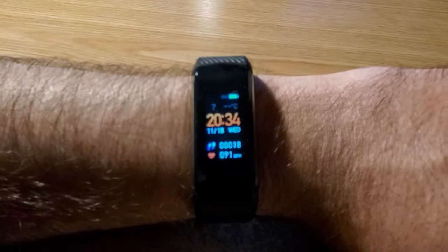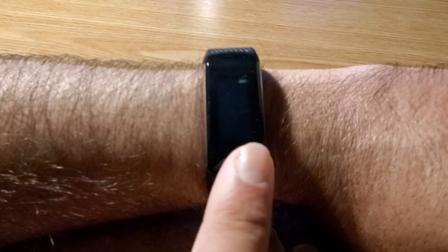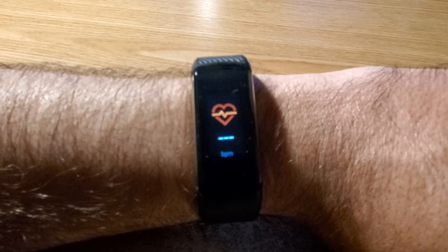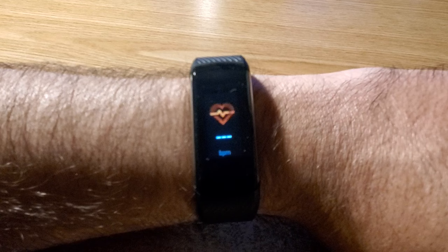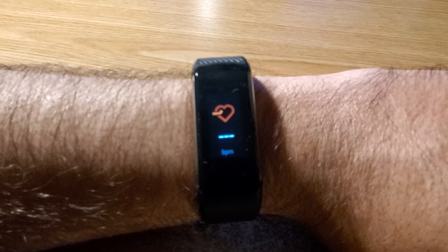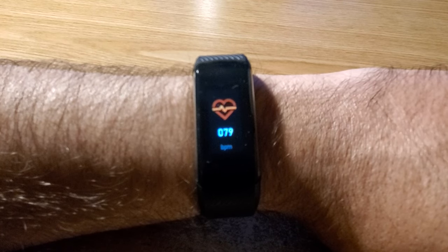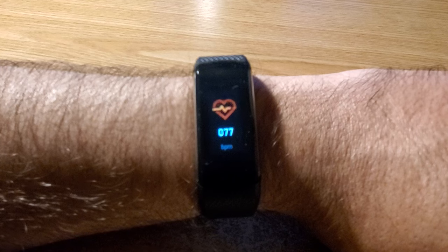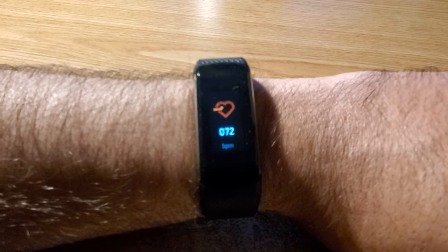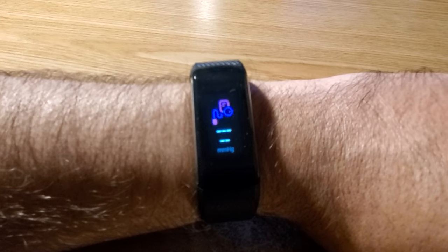To measure your pulse rate, tap the bottom part of the display until you see that icon, and it automatically starts measuring — you just have to wait a few seconds. There we go: 77 beats per minute, 72 beats per minute.